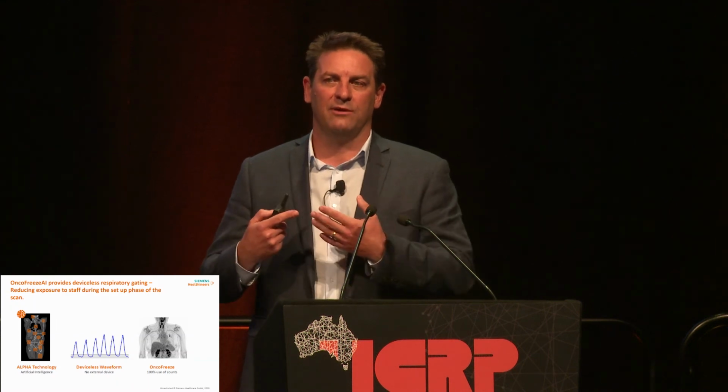So previously staff would need to set up a respiratory gating belt to measure the respiratory input, and we'd then use that to correct for motion. We're now able to use the list mode data from the PET scanner to correct.